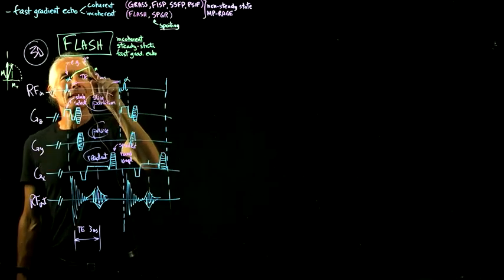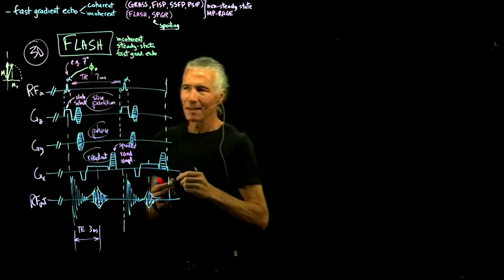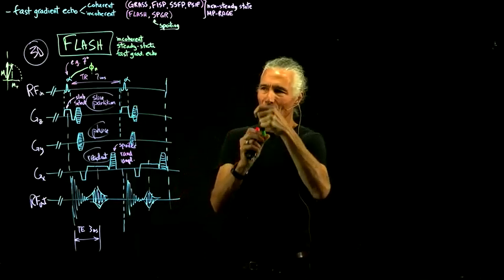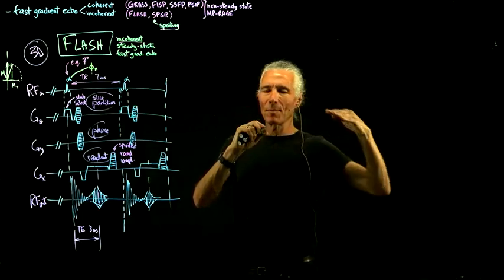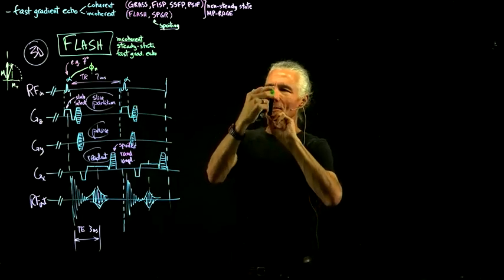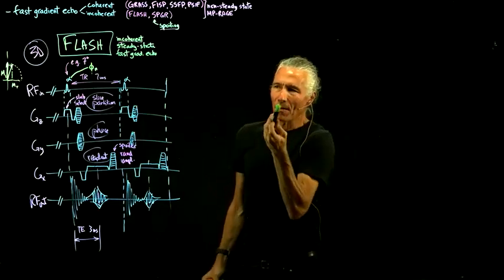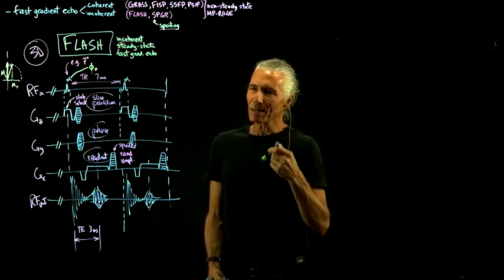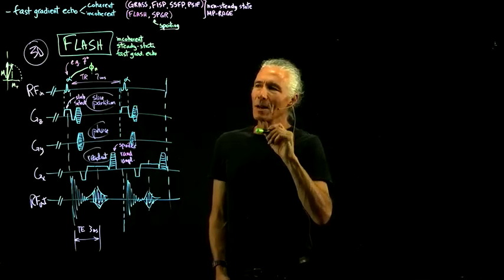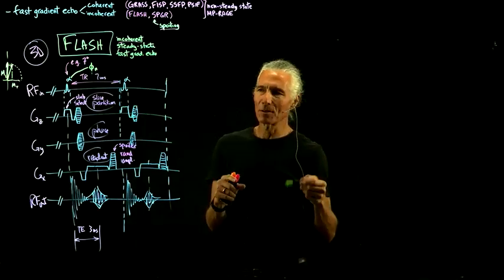That means where are you around the circle of phase? And what is the circle of phase? The circle of phase is perpendicular to the bore. So if this is the bore, the circle of phase is a plane perpendicular to that, and somewhere around that 360 degrees, you set the phase. But what does the phase mean? The phase means where is your oscillation with respect to time equals 0 set by the transmitter.